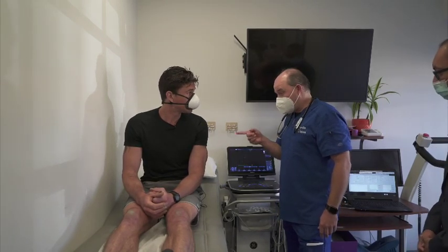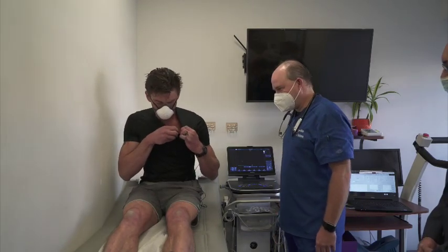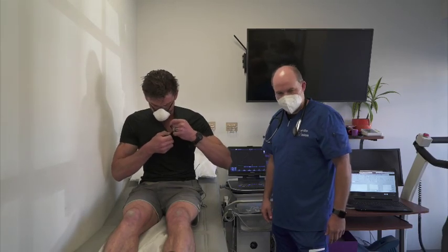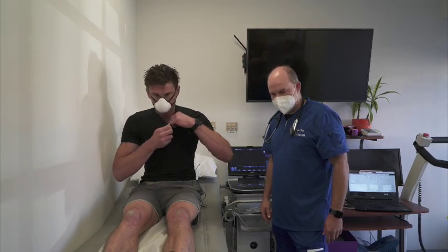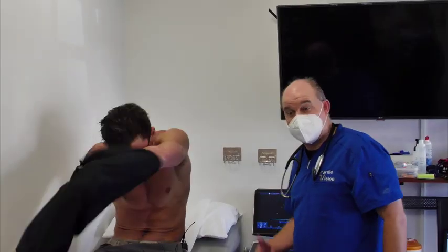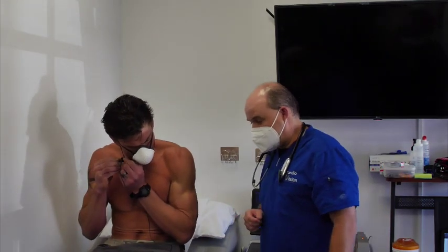It will require you to remove your shirt. I'm wearing a mic, but we can get creative. There are plenty of places I can attach this, including my mask. And as we progress through the rest of the testing, which will include going to the treadmill where we'll hook you up and all of that.